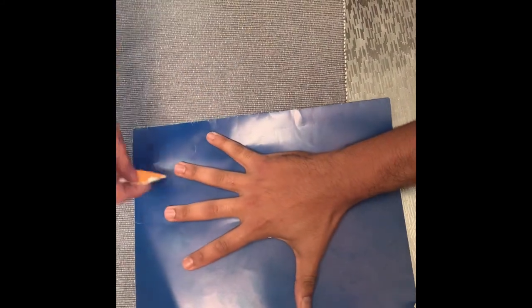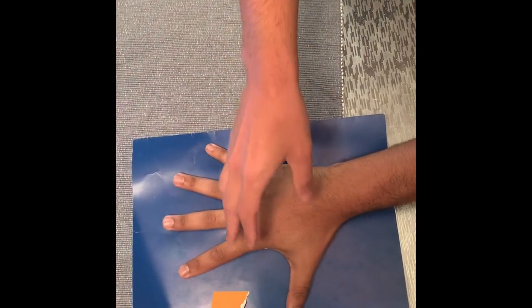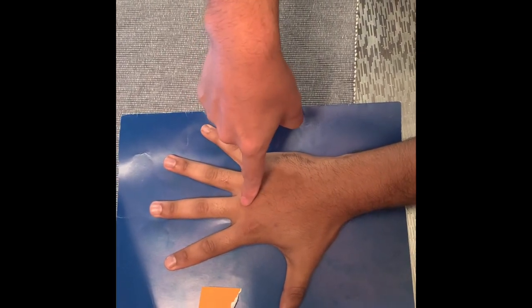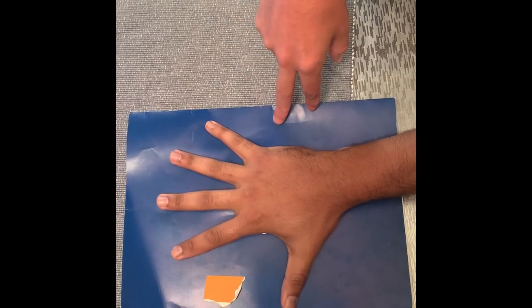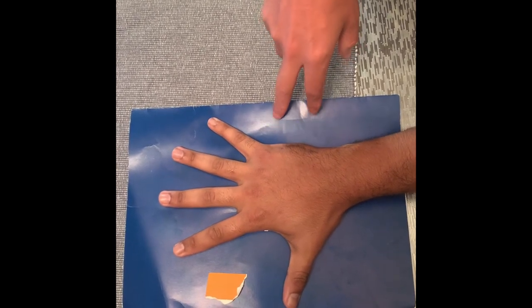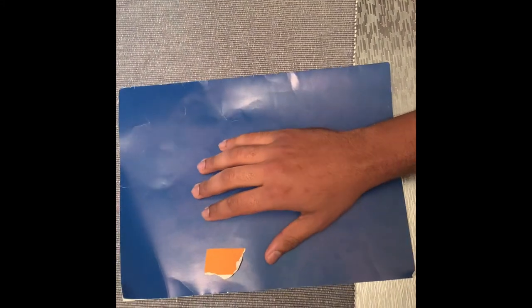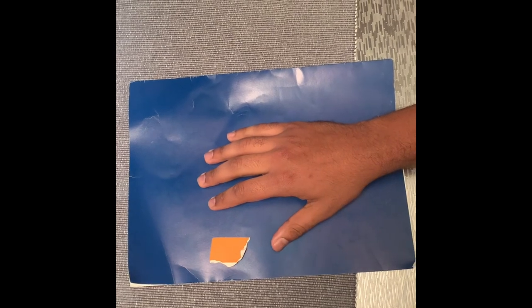We're going to start with the PA hand. Can you place your hand like this and expand the fingers? I'm going to put a marker right here. The central ray is going to be directed perpendicular to the third metacarpophalangeal joint, centered to the film. The anatomy demonstrated is going to be the PA projection of the carpal, metacarpal, and phalangeal articulations of the hand, and the distal ends of the radius. Don't move — click — perfect, relax.